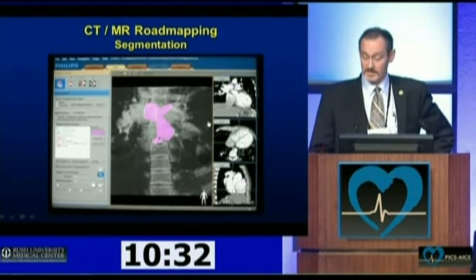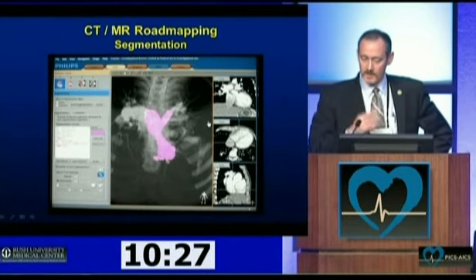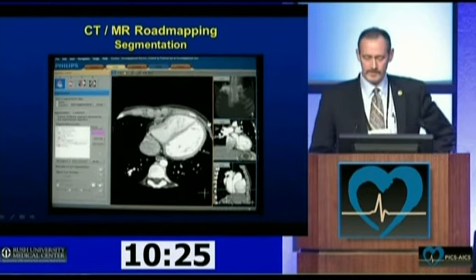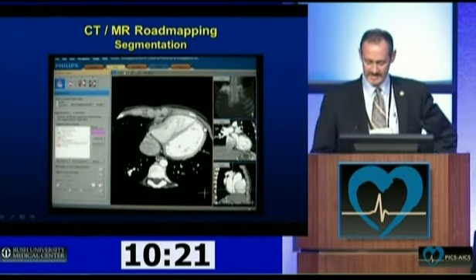A lot of this is done by myself or the other physicians. My imaging docs do a fair amount of it, Dr. Brian Fonseca. But this is the type of image that you can get when you finish, and that's the segmentation process to define the anatomy.